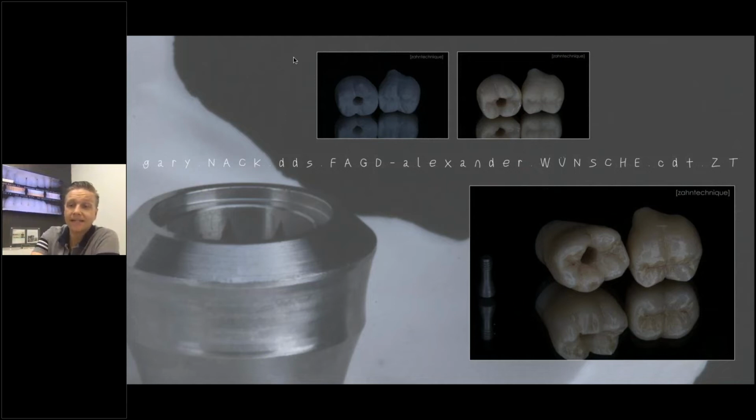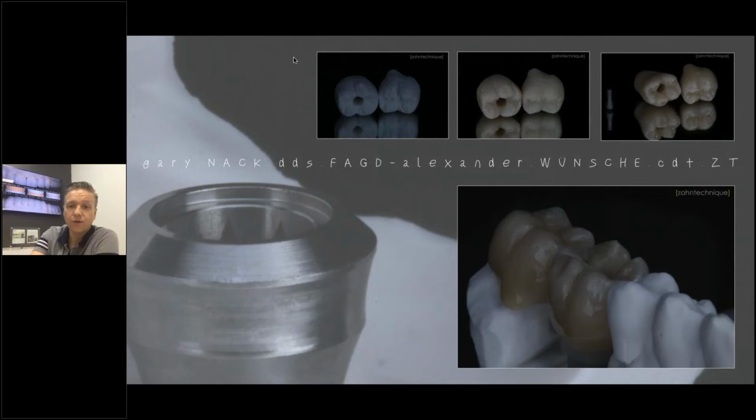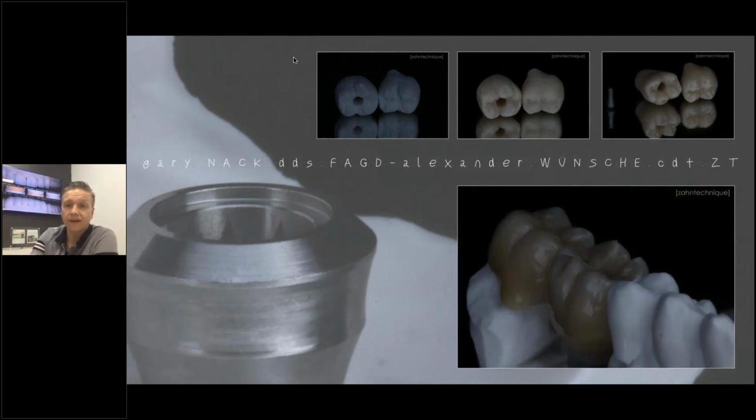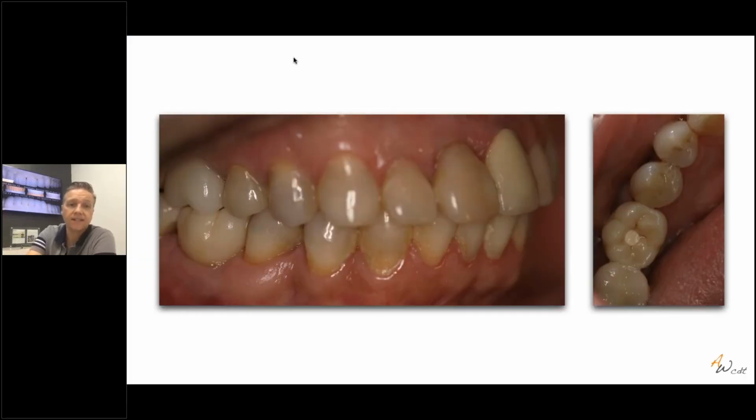Here the crowns are glazed and ready to go, ready for the big show. Here on the model, a different view. And then here we see the case seated. You see also multiple different colors, but it definitely blends in nicely, as good as we can. I mean, you see there's some tissue recession, so we definitely have to take this into consideration when we look at the case. But for a monolithic material, that's, in my mind, not bad. That definitely we can look at.